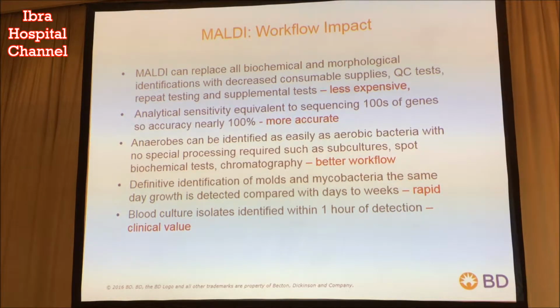you had results. With mass spectrometry, you look at your anaerobic plate, you see a colony, you pick the colony and you can identify it. You don't have to prove it's an anaerobe because you're going to get the name of the organism. So it turns out to be a much better workflow than what we've seen historically, and that was just one example. We developed databases for literally every major group of organisms, including the anaerobes, including molds, including mycobacteria.